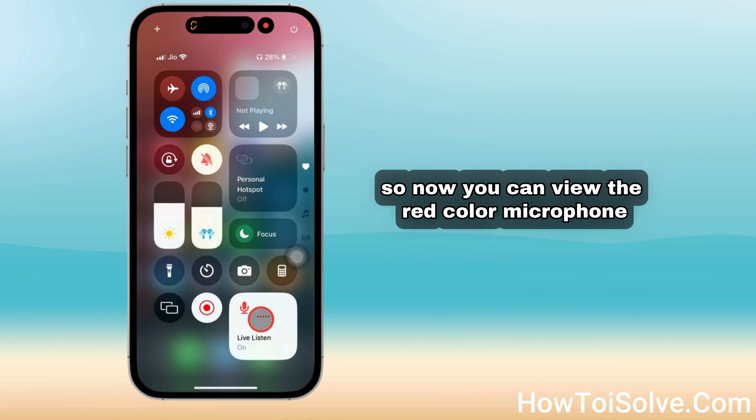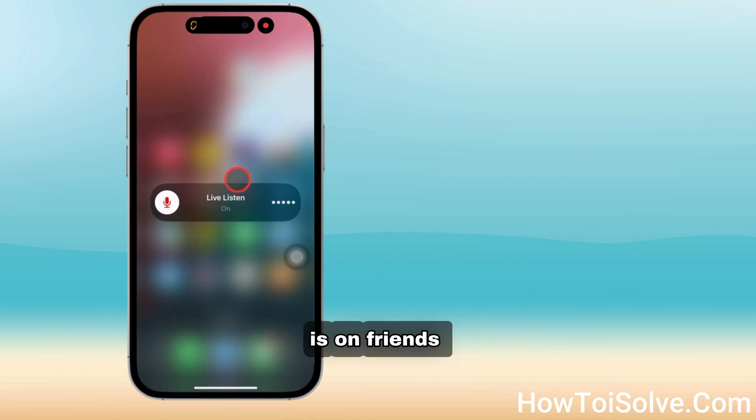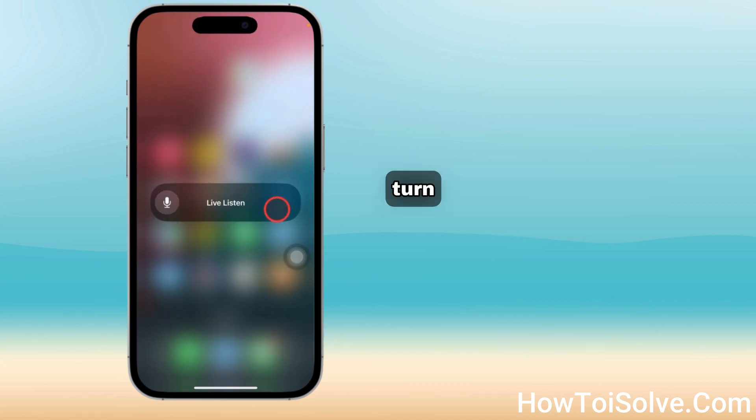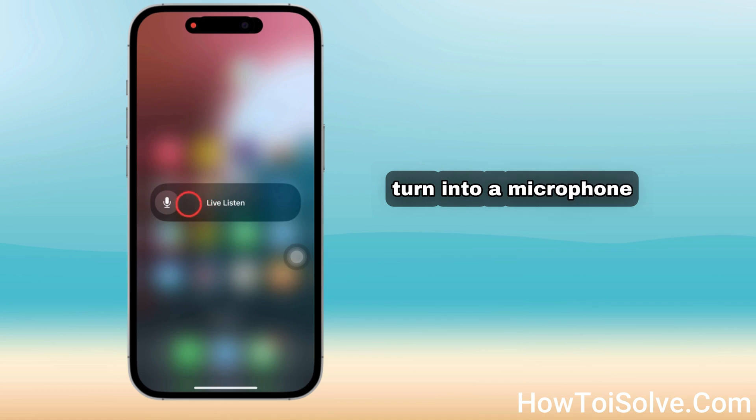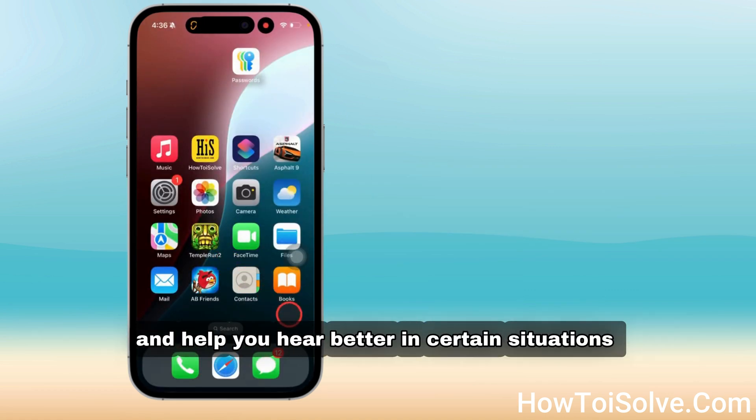Now you can view the red color microphone which says Live Listen is on. You can see that your phone has turned into a microphone to amplify sounds and help you hear better in certain situations.